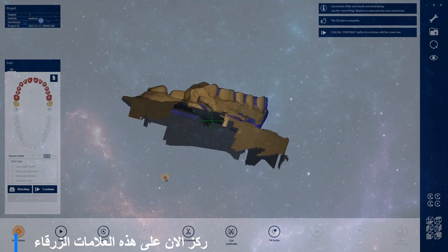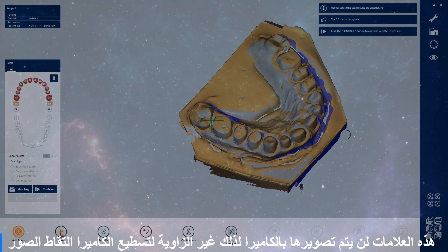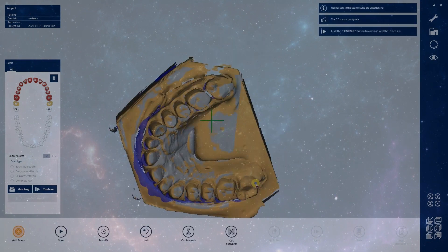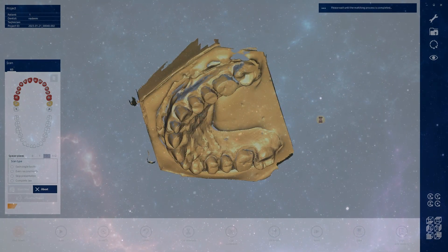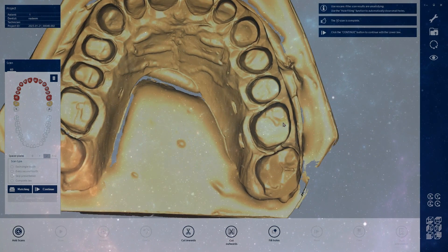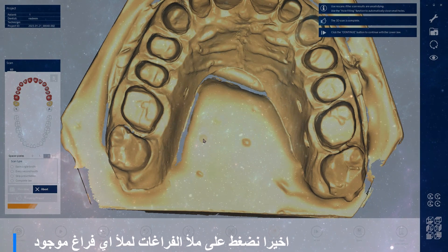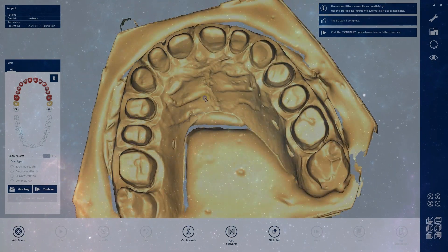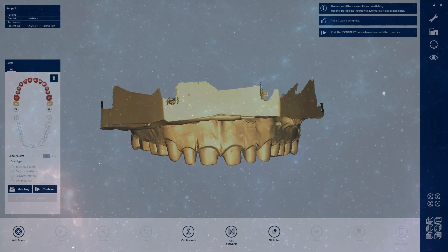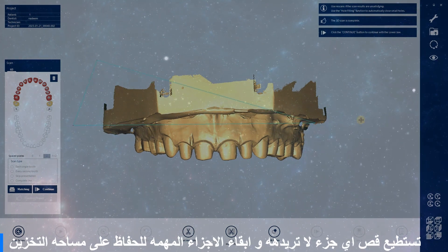Focus on this blue shadow — this will not be captured by the camera, so you must rotate to take the best angle to get your shot. Finally, we will press fill holes to fill the holes automatically. You can cut anything extra that you want, to avoid wasting data.